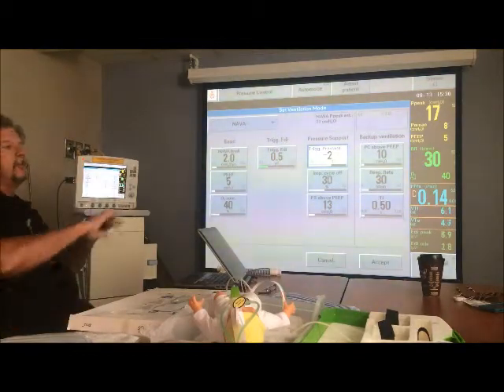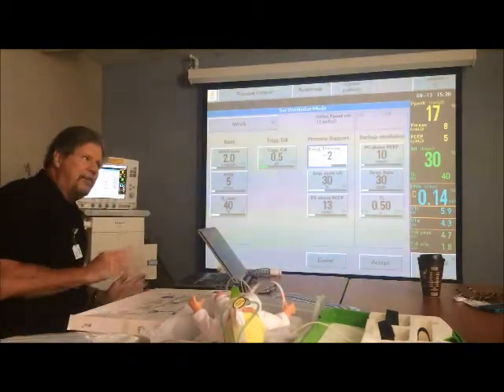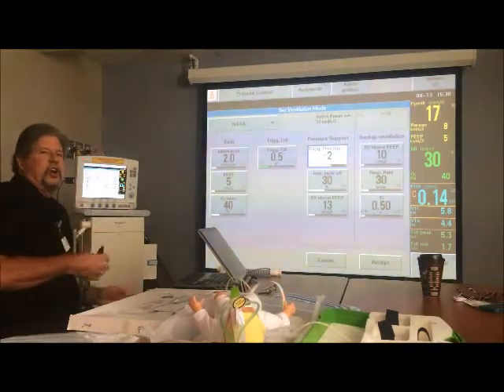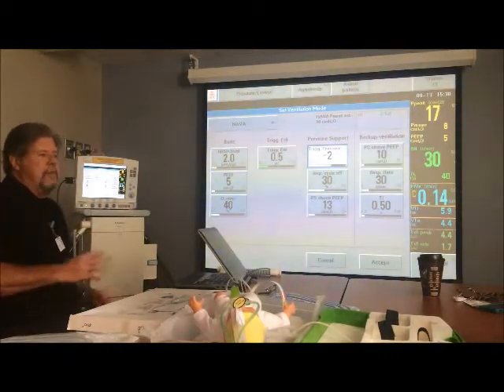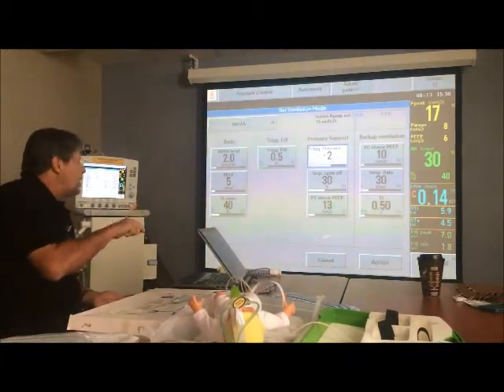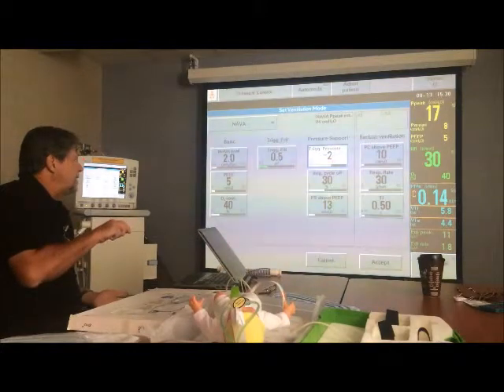So, go ahead. She was just wanting to remind you that this is invasive only. I'm going through the whole theory of NAVA in full, but then I'll condense the whole in-service down to about 5 minutes, and then we'll see what we're going to use it for. Yeah.